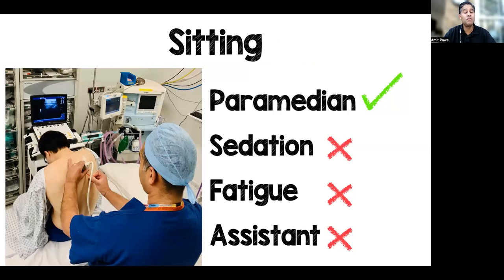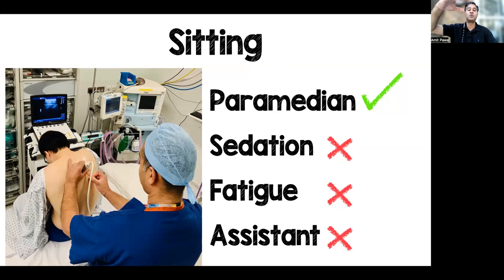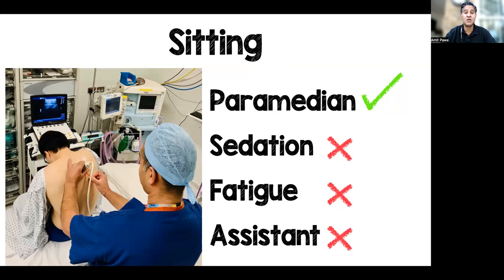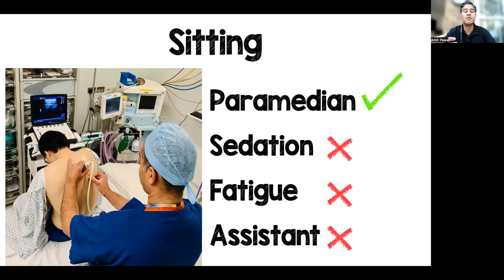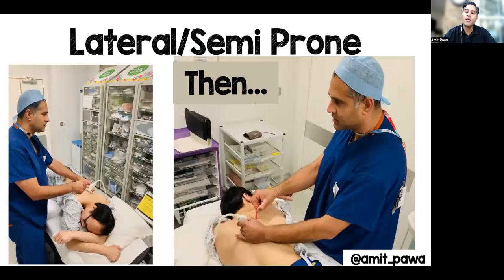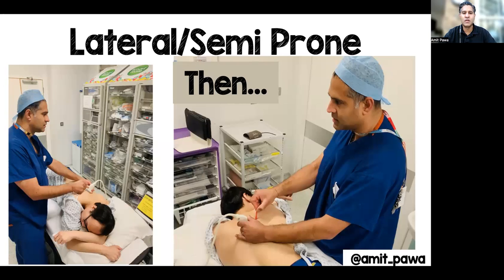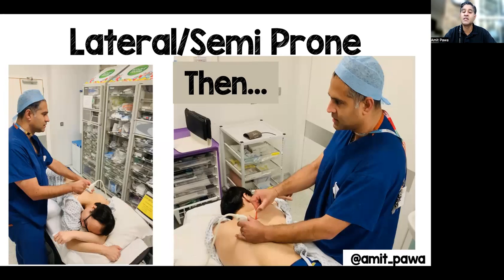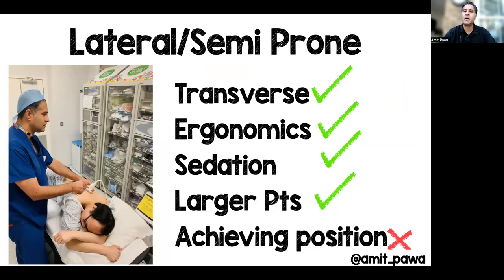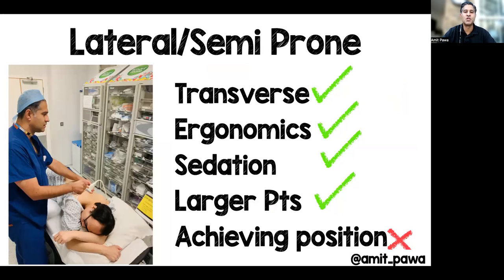Once you start lifting your arms away from the trunk and above shoulder level you can easily fatigue, and you definitely require an assistant holding the patient — it's relatively labor-intensive. I then moved to the lateral or semi-prone position, which was really nice for needle insertion. The ergonomics made sense for the transverse in-plane approach, patients tolerated sedation well in that position, and for larger patients it made paravertebral block insertion very easy.